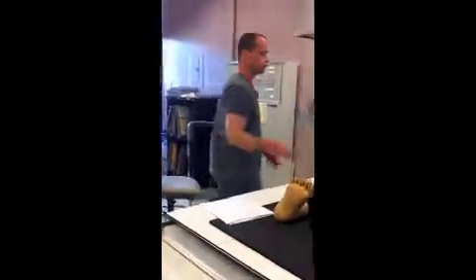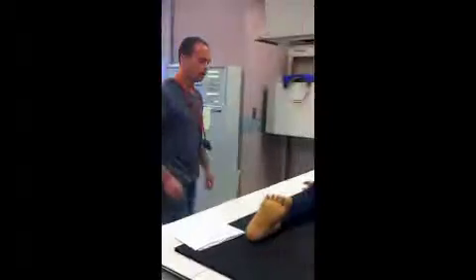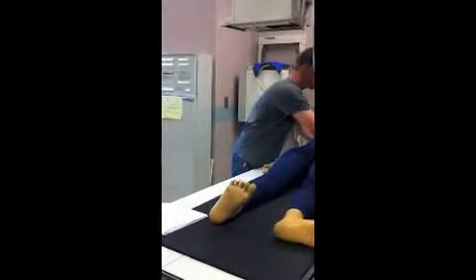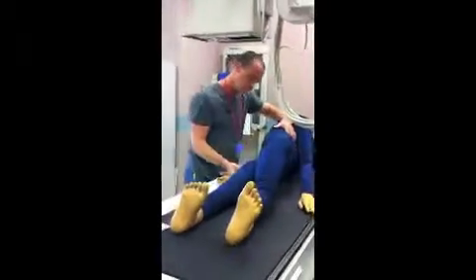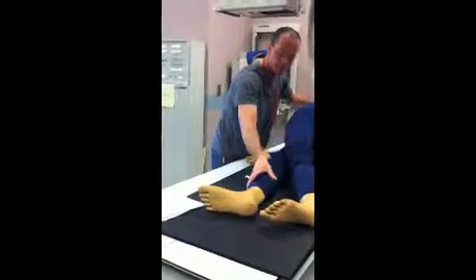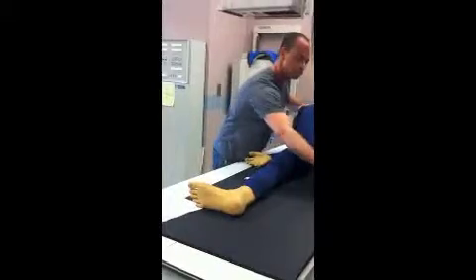Don't move. Now for the lateral knee. You have the patient roll over onto his or her affected side. You want the affected leg in front and the unaffected leg behind.